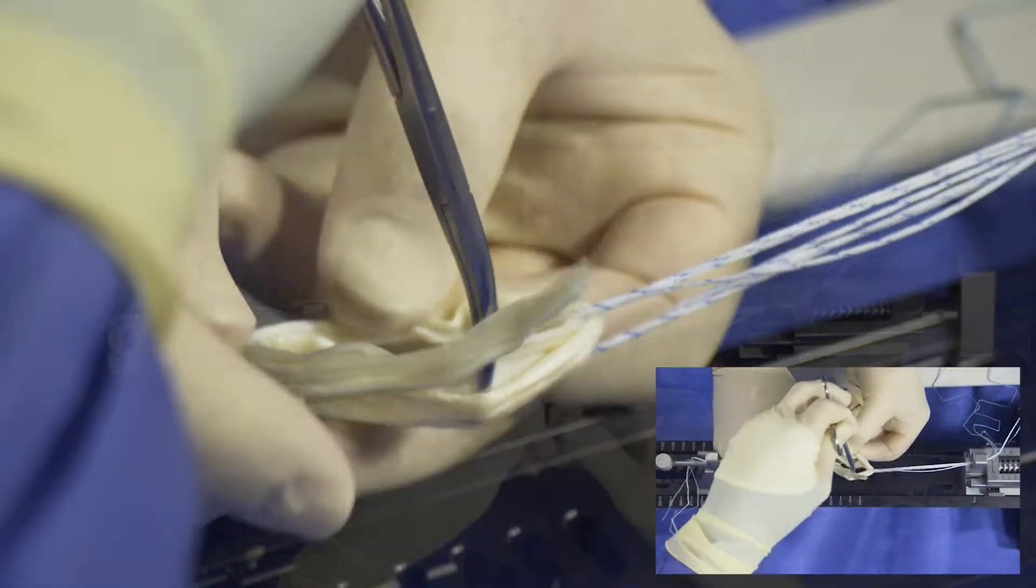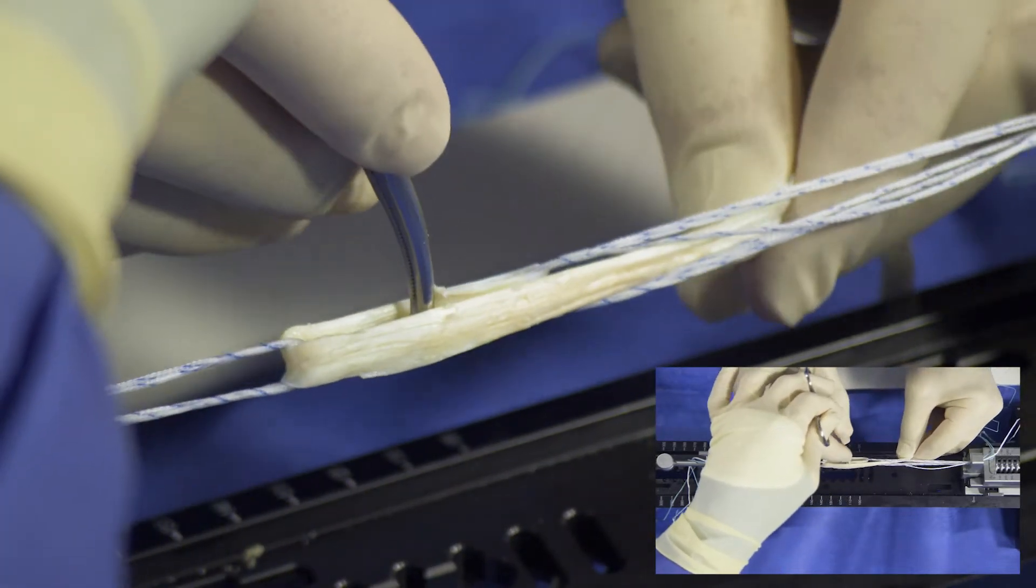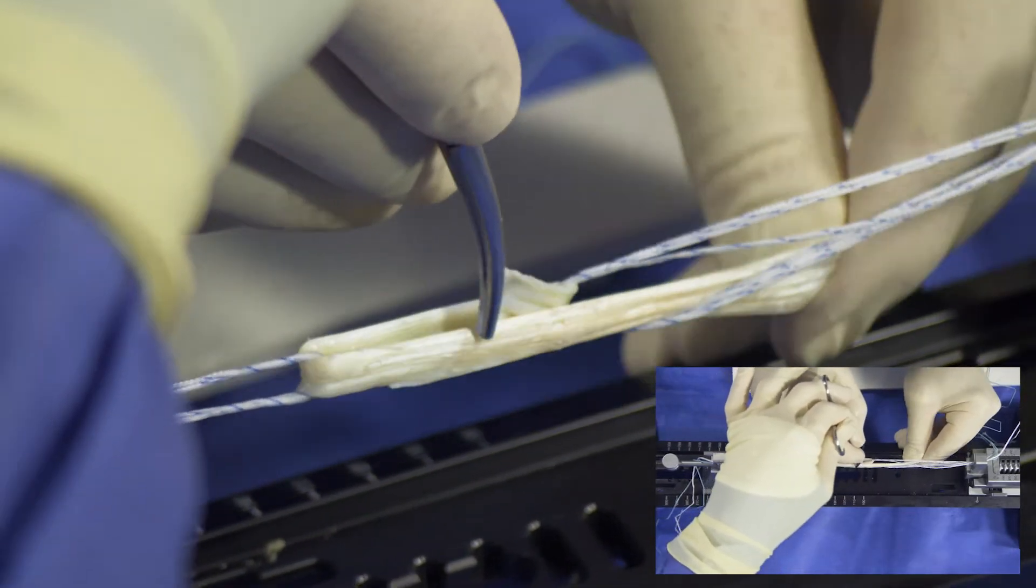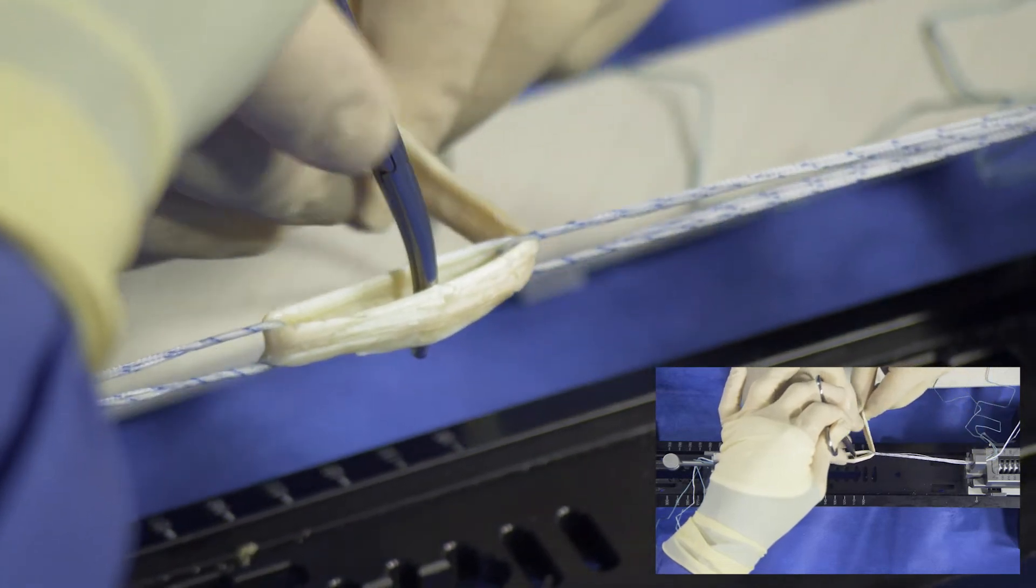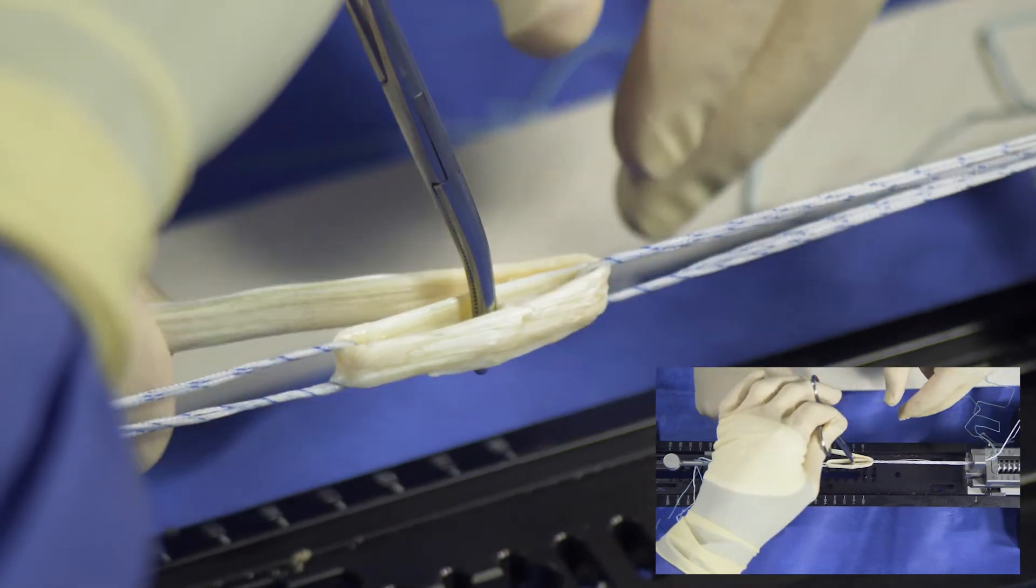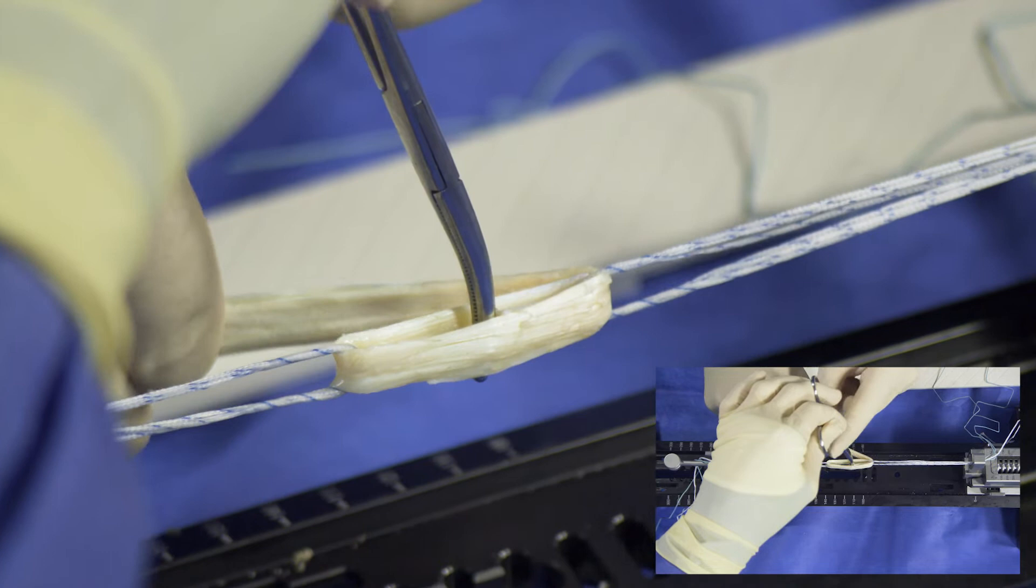The posts are normally set between 240 and 260 millimeters depending on graft length. Most of the time the entire tendon is utilized and is typically proportional to height.